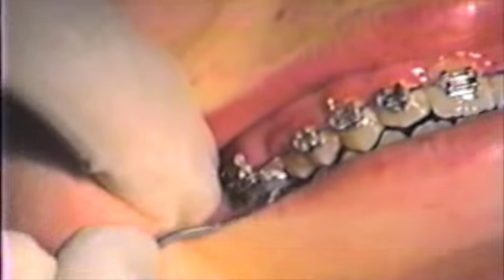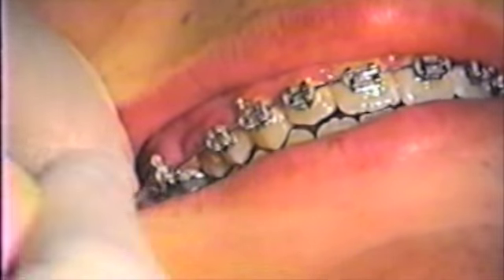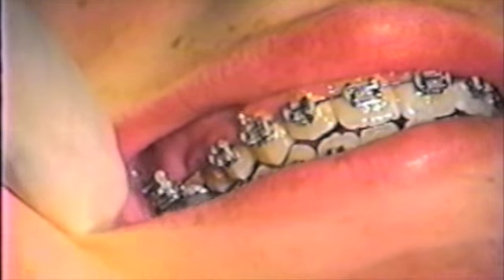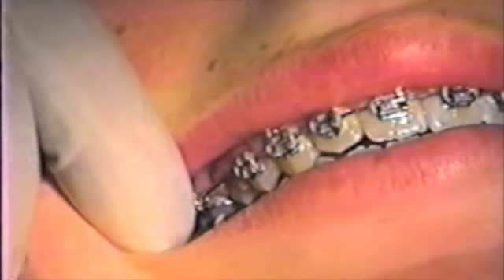We will need to bend the molar hook out to allow engagement of one end of the safe spring.